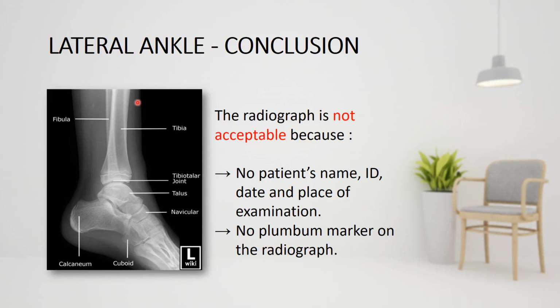Okay, for the conclusion of the lateral ankle projection, this radiograph is not acceptable because there is no patient name, ID, date, and place of examination. The second point is there is also no lead marker on the radiograph.